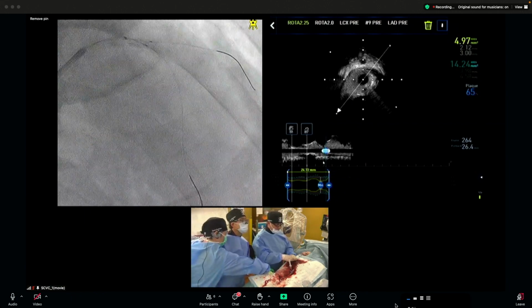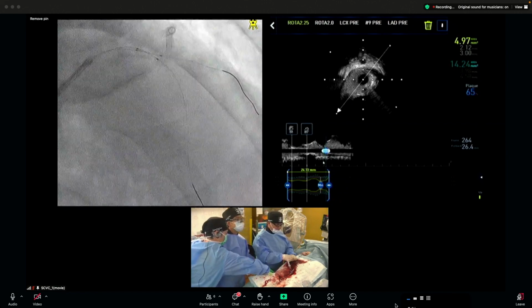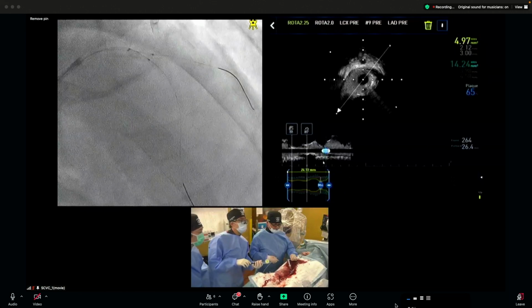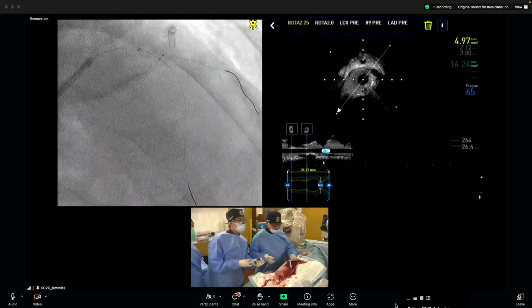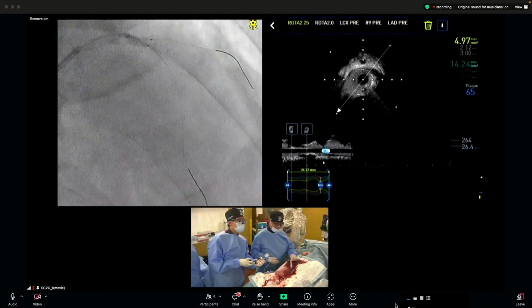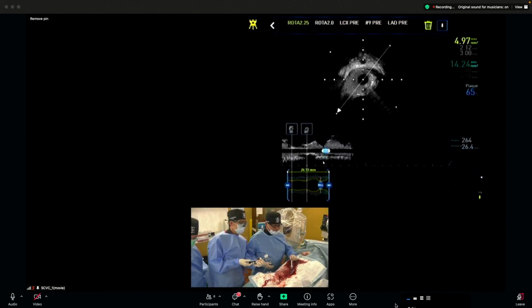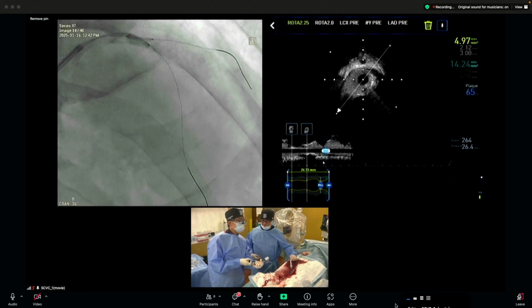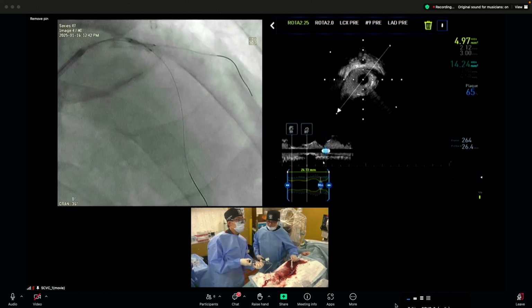But I want to ask any panelists or Dr. Kishima, we really want to protect the side branch, which is a big side branch, with a very high chance of occlusion during rotablation. Is there any other genius way of doing that? The SCAI, in a consensus statement, recommended that, but I never tried that. I'm not sure any panelists have tried that before.